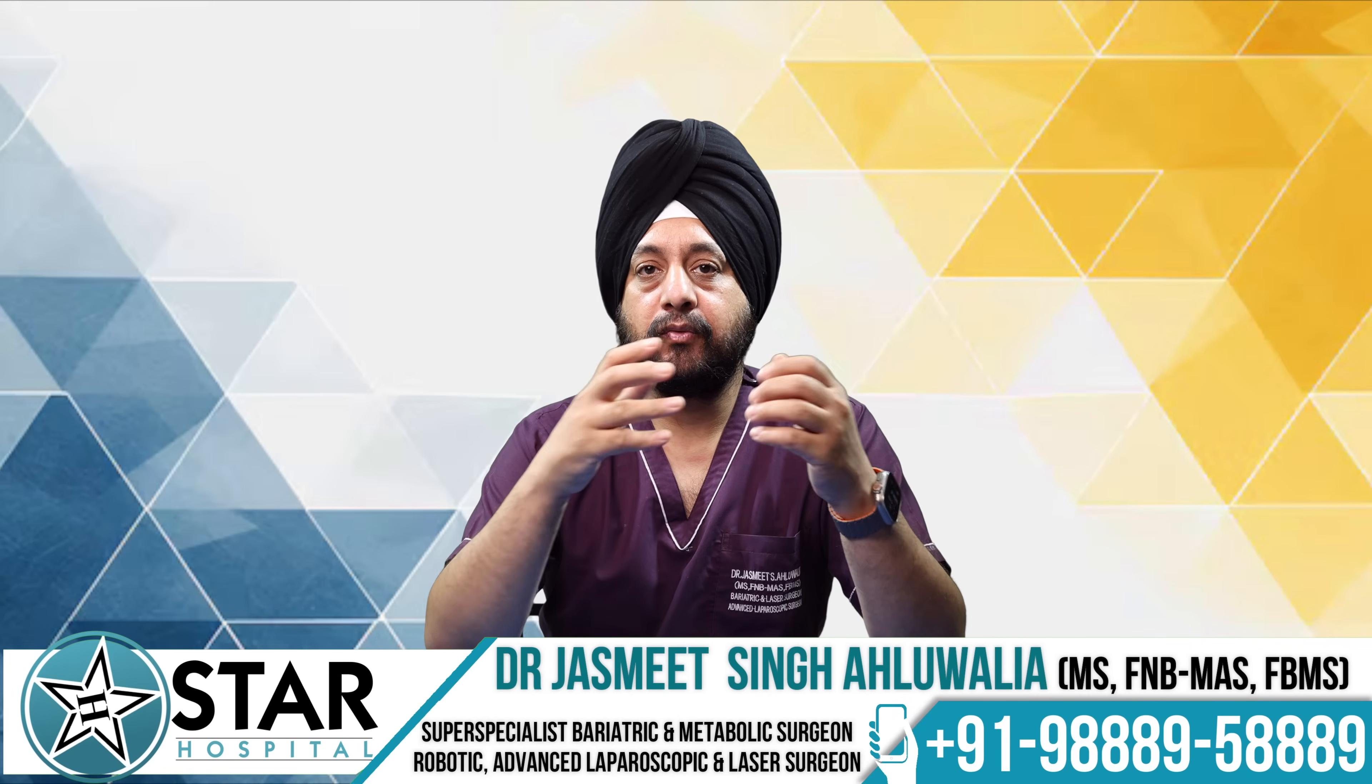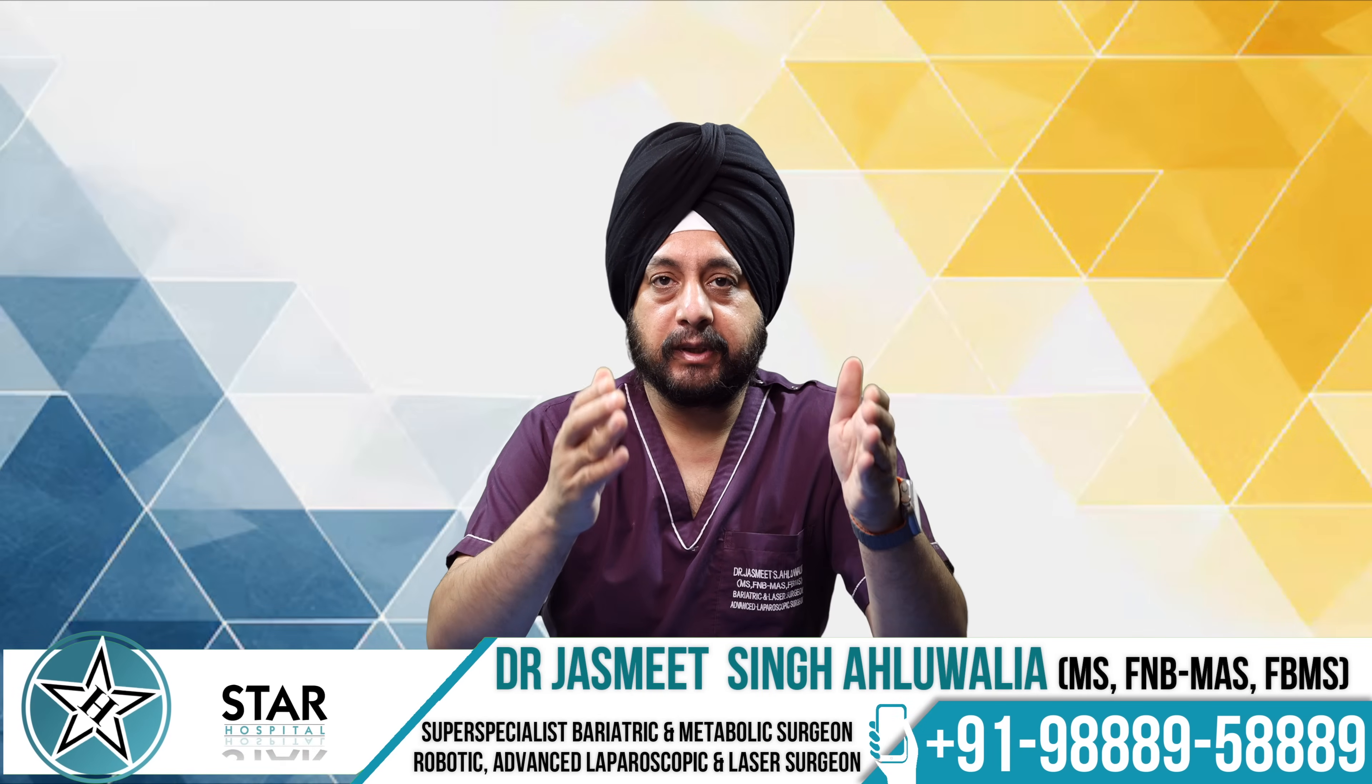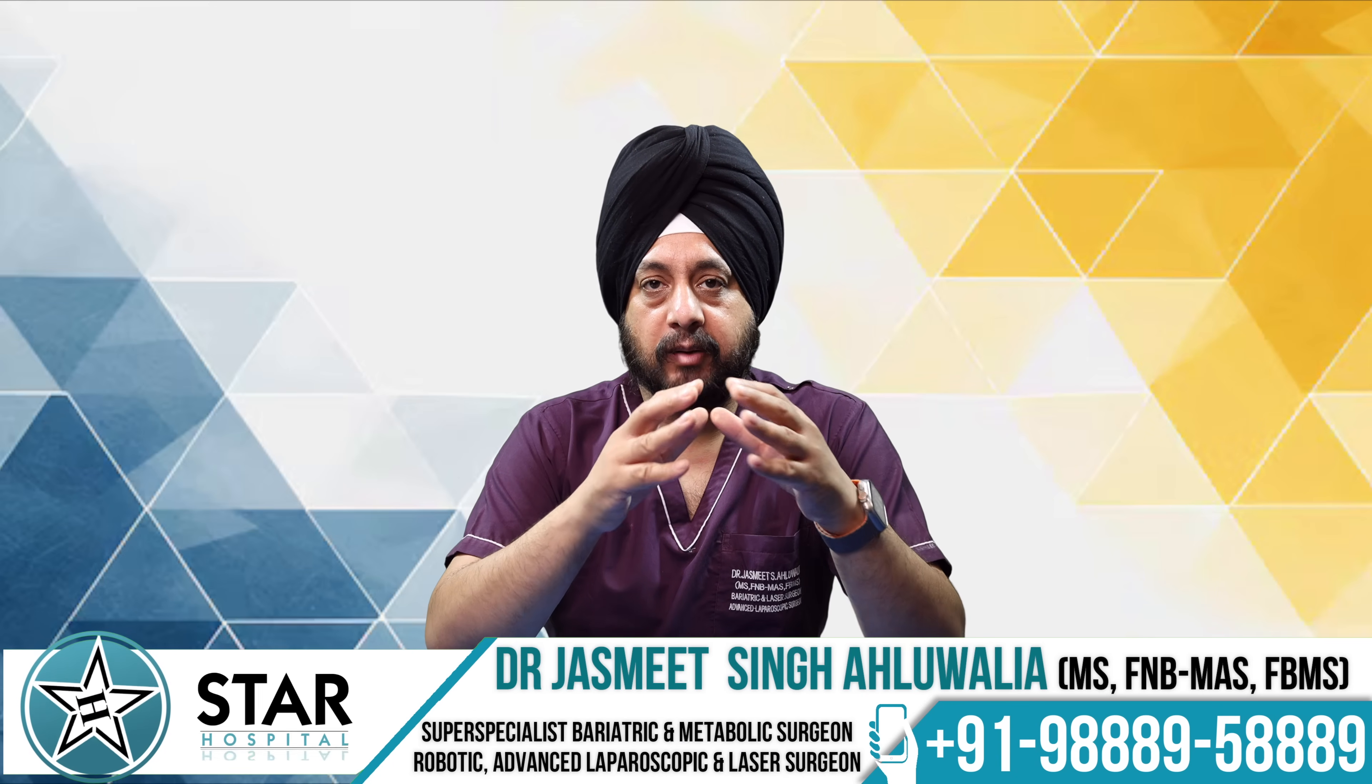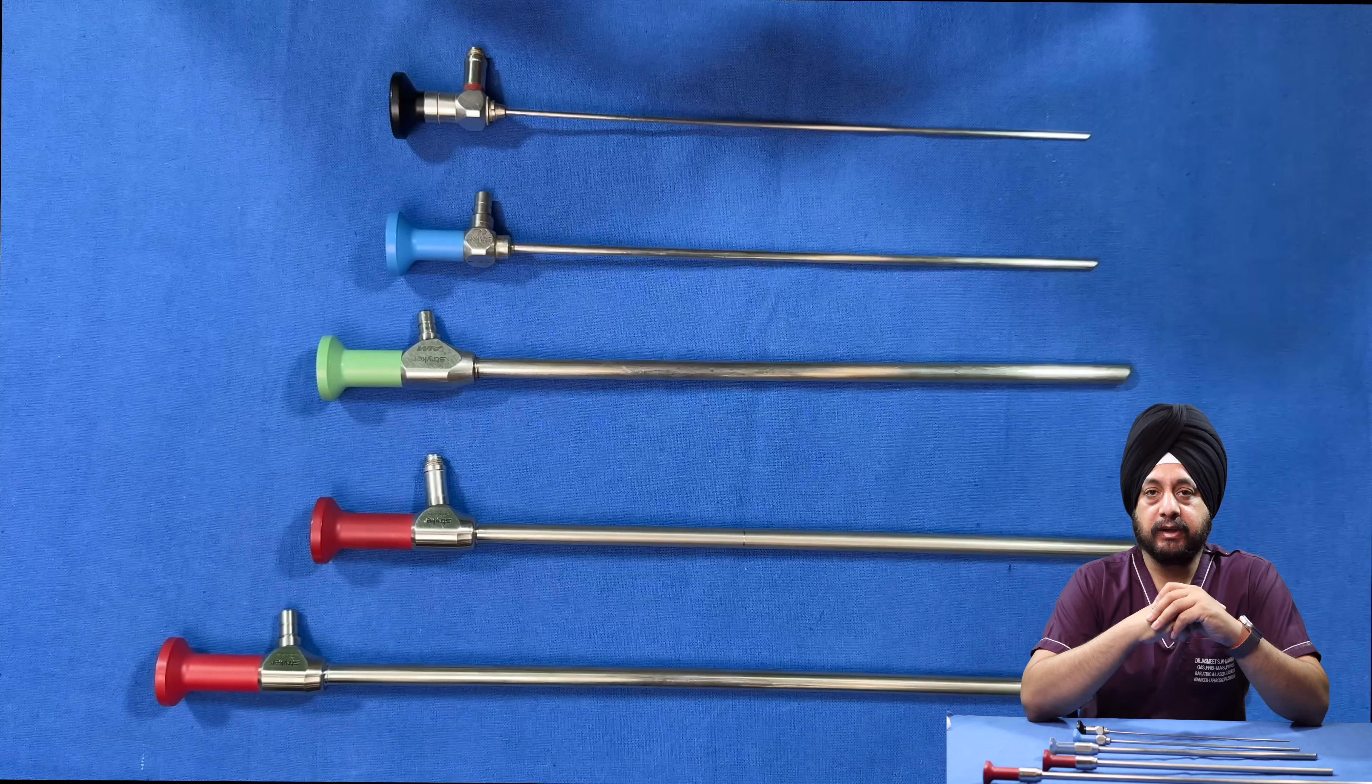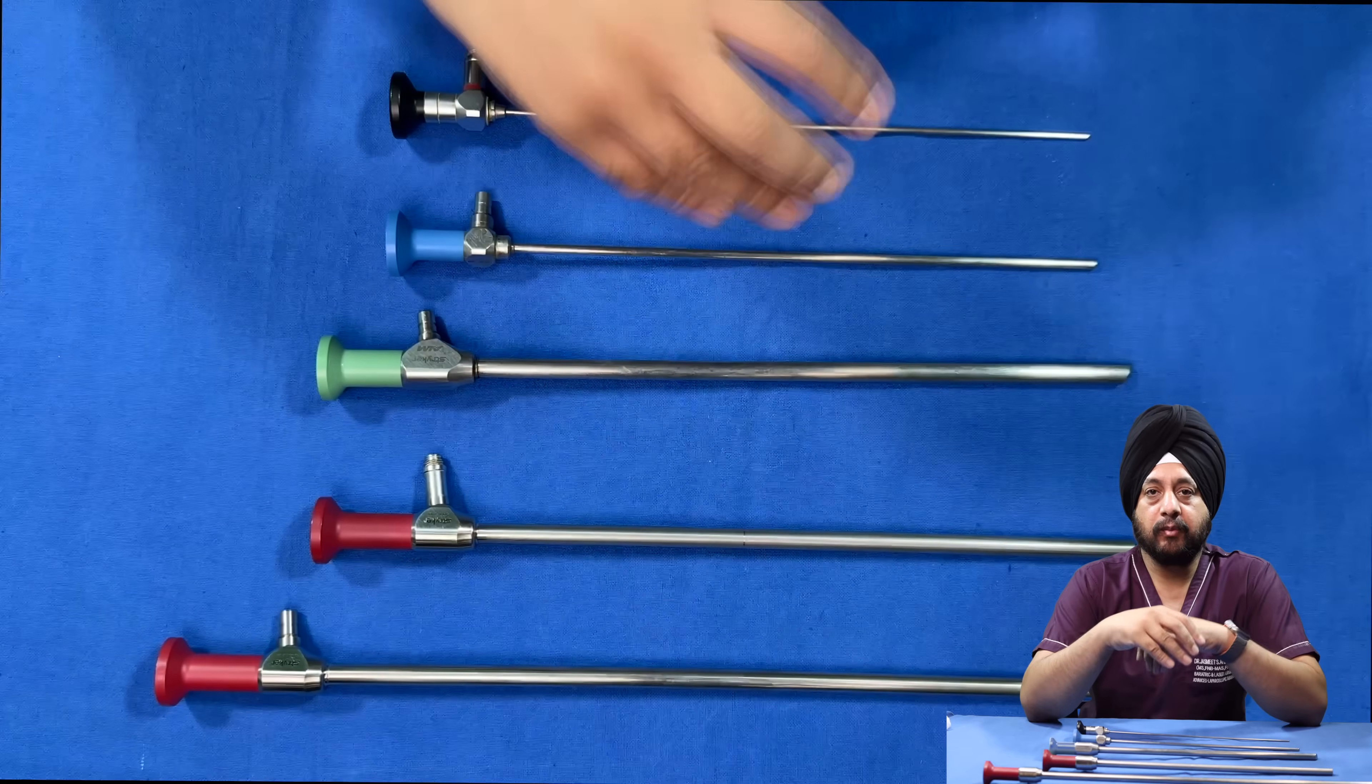If your procedure demands high clarity of vision, go for a bigger scope. For a smaller patient like in pediatric laparoscopic surgeries, when the abdominal cavity is much smaller, a smaller amount of light can give you better image quality. For an adult where the abdominal cavity is much larger, you need much more light, so use a larger scope.